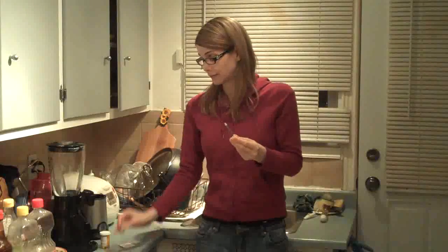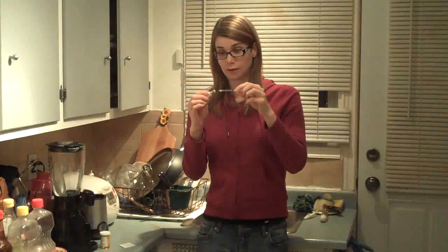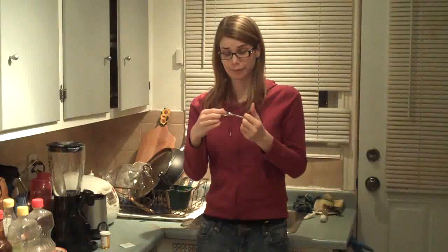The first thing I'm going to do is pull some air into my needle and then inject the air into the vial — this is going to help me suck the fluid out. Now, this is a very small gauge needle, so usually people use bigger gauge needles because sucking fluid through a bigger needle is easier. But even though this needle is very small — I think it's about 28 gauge — you can still get the oil through here.